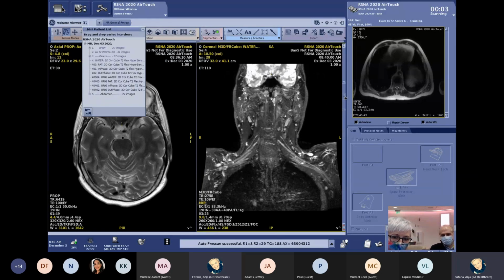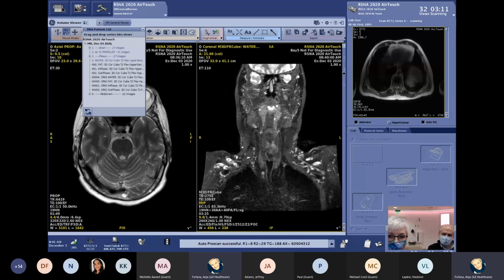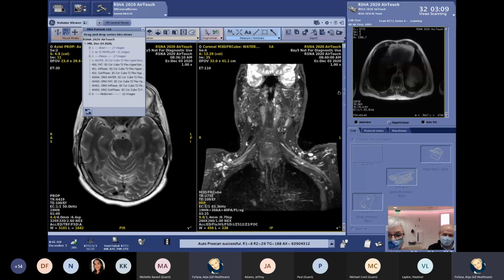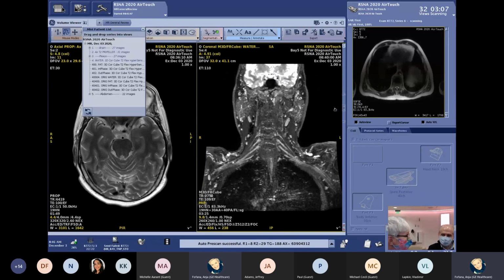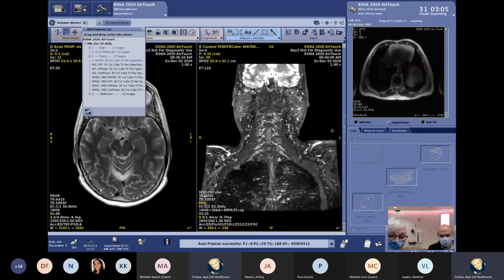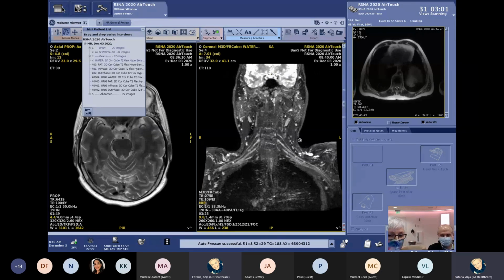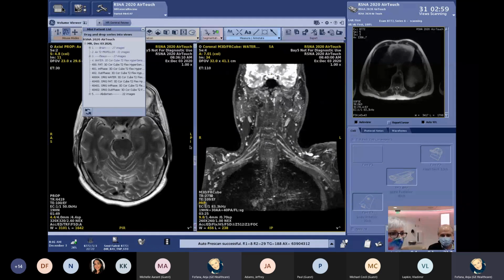So that is something when I had to start scanning plexus, I can admit that I hated that examination because I never was able to find any nerve. But now with having the 3D sequence and Cube available and all these coil management available, it's so easy to do. So now I wouldn't bother anymore when somebody came and just say scan a plexus.